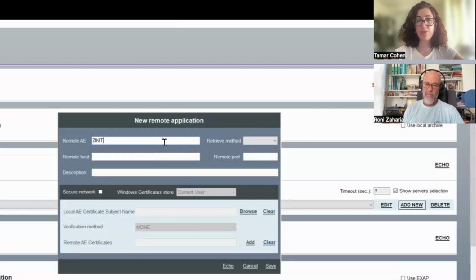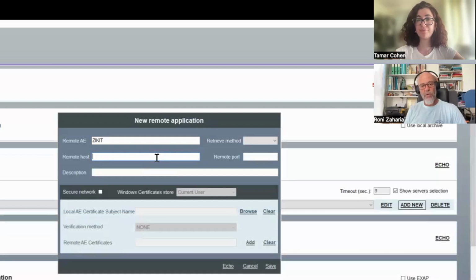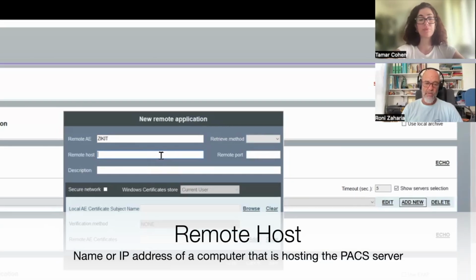So next we have the remote host. What is the remote host? A host name is the name of the computer in the general network, the TCP/IP network. We can use either a host name or an IP address. The host name of our PACS is Carlos. It's not case sensitive in this case.